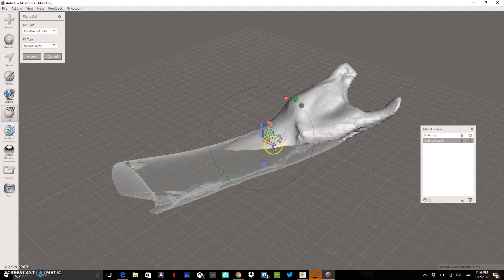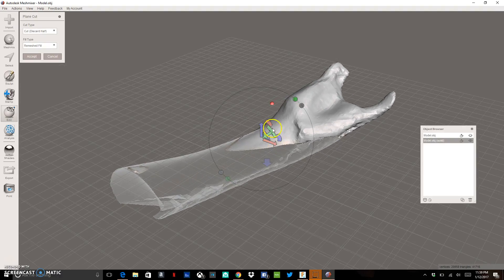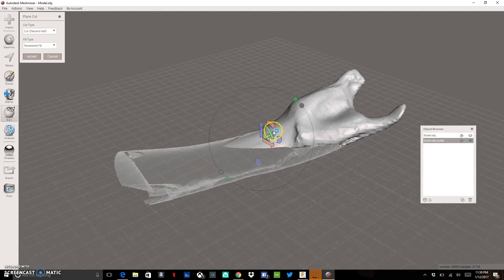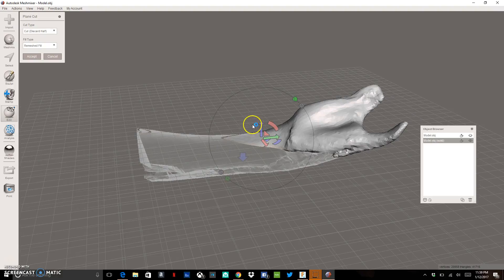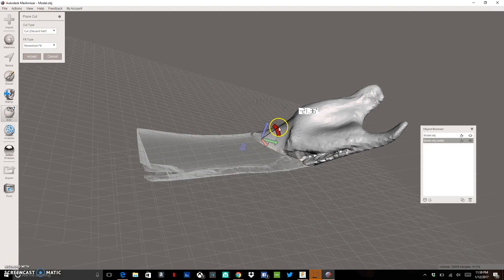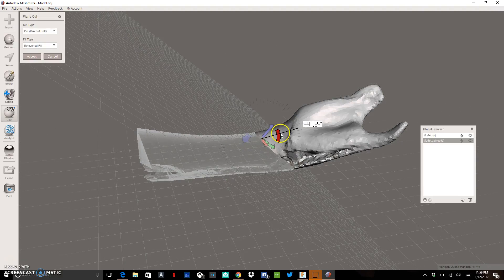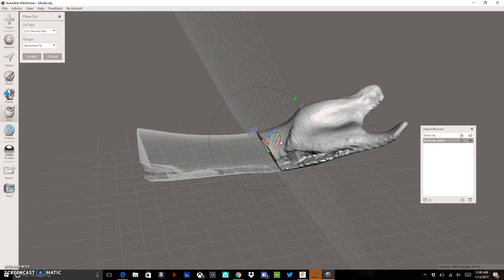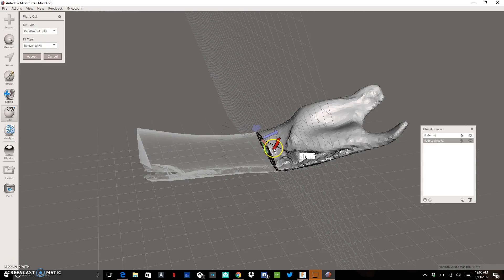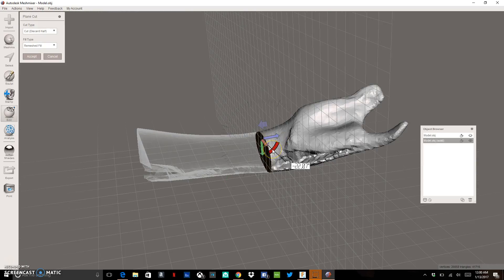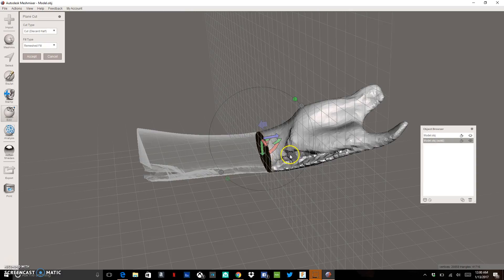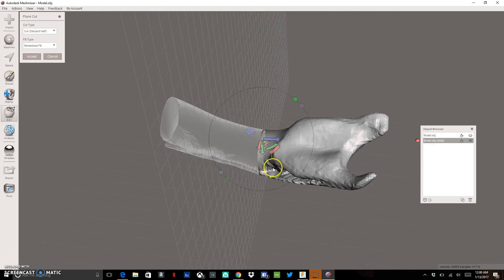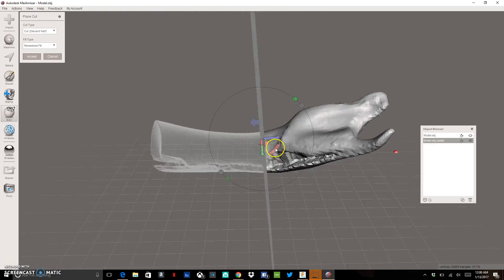So as I look at these, I can use these little circles to adjust the angular orientation of my plane. So I can kind of rotate this around and I can start to get my plane so that it's only cutting off the bottom part of that hand.